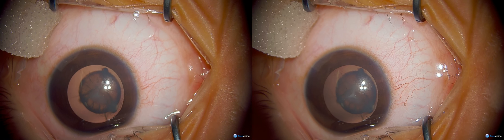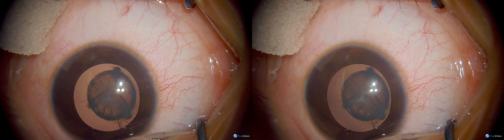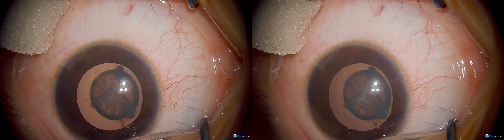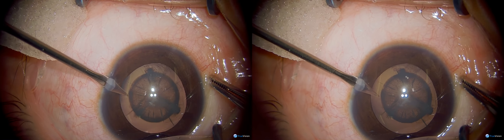As you can see at the beginning of the case, we're making a small secondary incision to allow us to inject air and some trypan blue for capsular staining. This is being used because the capsulotomy is going to be right over the area of the nuclear cataract.